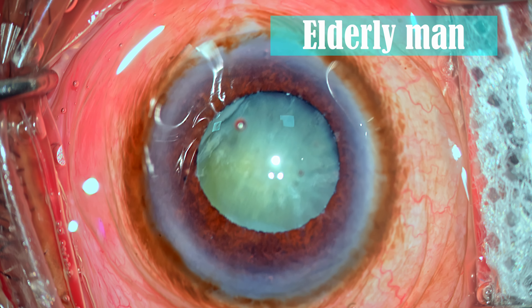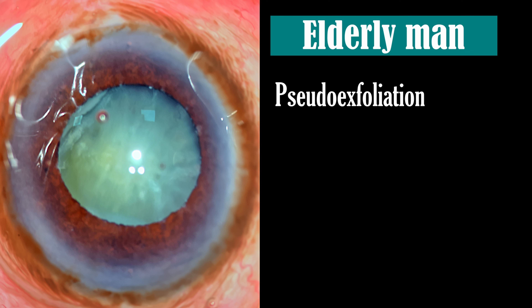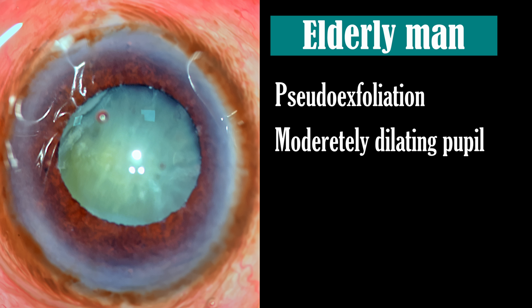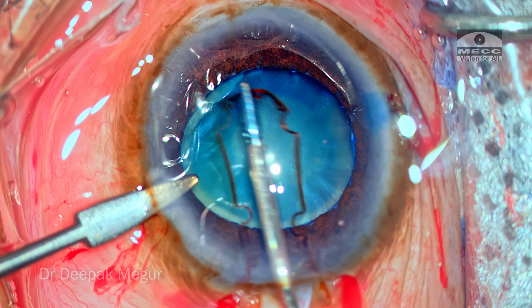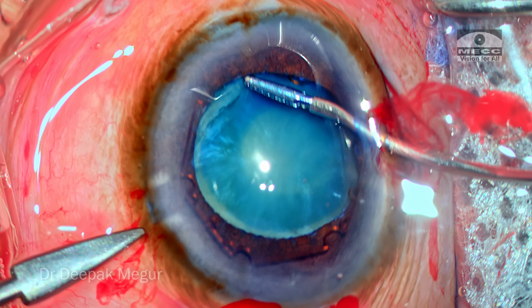He is an elderly male patient who has pseudoexfoliation and a moderately dilating pupil. I'm expecting some amount of zonular weakness in this eye. He also has a mature cataract which does not look very hard. Let's go through the case and see when the problem begins.